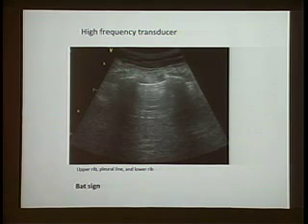So it's interesting, because now you're going to have the following scenario. You're going to use all the artifacts that you have to make a diagnosis. Air does not transmit ultrasound, and you're going to use that to your advantage. It used to be that we thought that we couldn't use ultrasound for the lung. Yes, we can. I'm going to show you some examples of that.